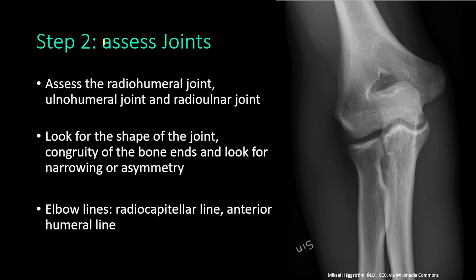Moving to step two, which is assessment of the joints. You assess the radio-humeral joint, the ulno-humeral joint, and the radio-ulnar joint. In each joint you look for the shape, the congruity of the bone ends, and any narrowing or asymmetry in the joint space. The radio-humeral joint here looks normal.